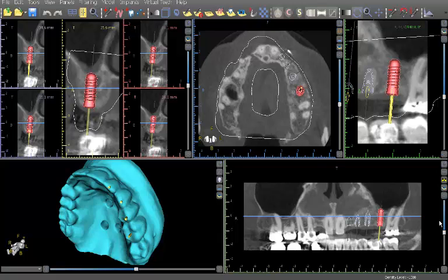Guided surgery is dependent on visualization of future tooth position. The drill guide will deliver a hole where it is aimed. The challenge is to create a surgical plan which aims the guide correctly. To meet this challenge, virtual planning software must include the necessary data for visualizing future tooth position.